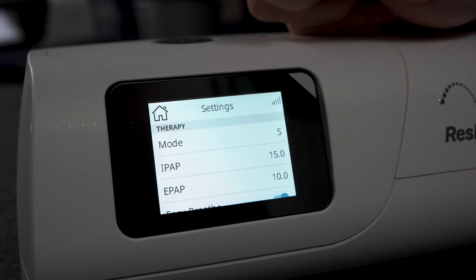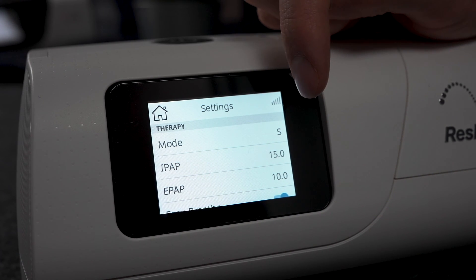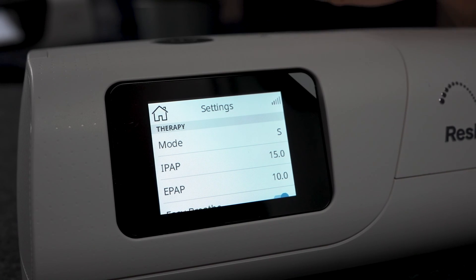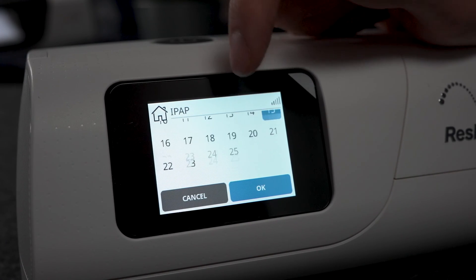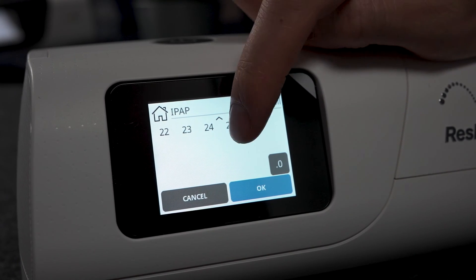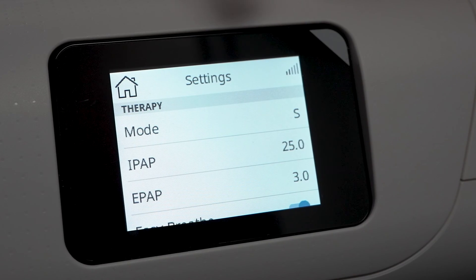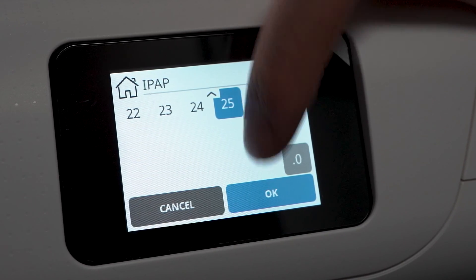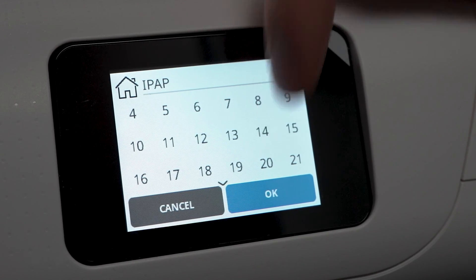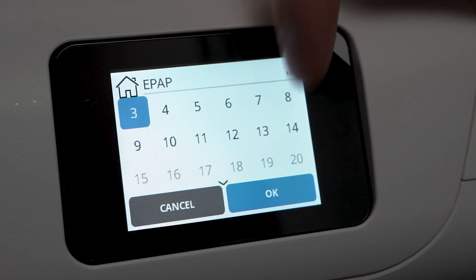In S mode, we have our IPAP pressure and our EPAP pressure. IPAP is set to 15 — meaning you're inhaling at 15 — and EPAP is set to 10, so you're exhaling at 10. We can change these to whatever we want. For example, we could set IPAP to 25 and EPAP to 3, which is the widest possible variance, though most people will have a pressure difference of around 4 to 6. So a typical setting might be an inhale of 14 and an exhale of around 8.